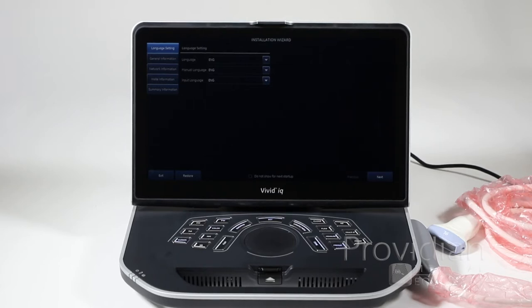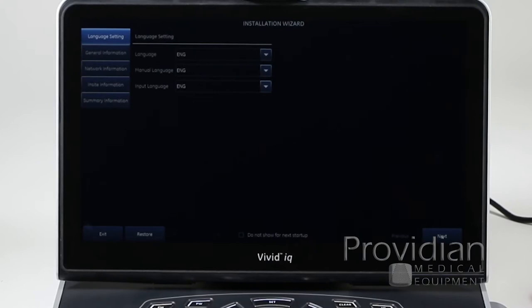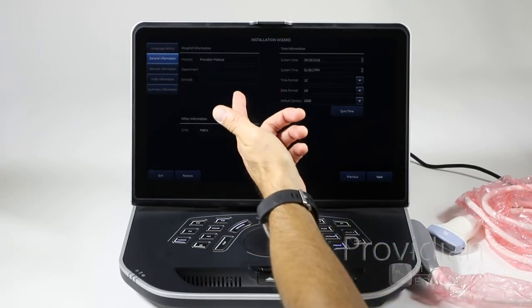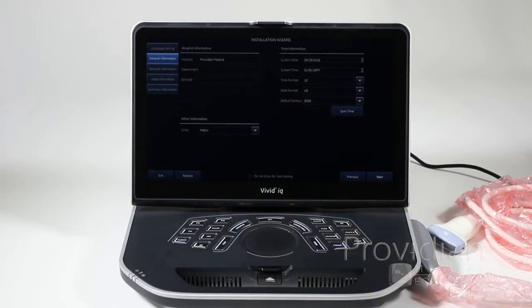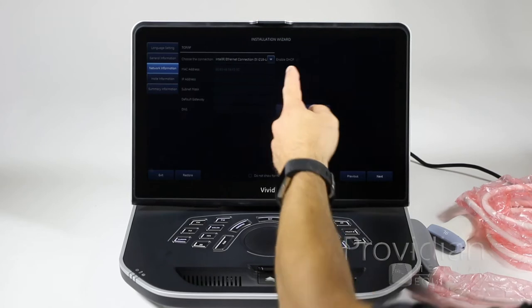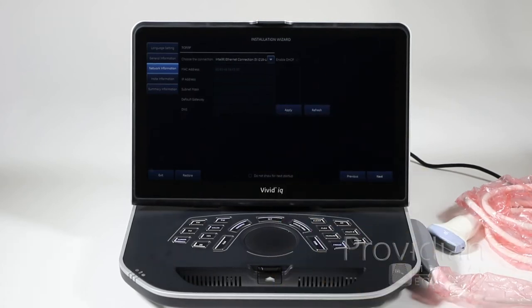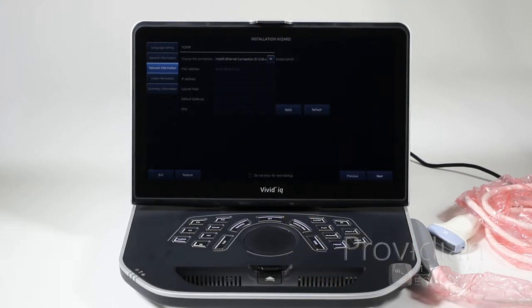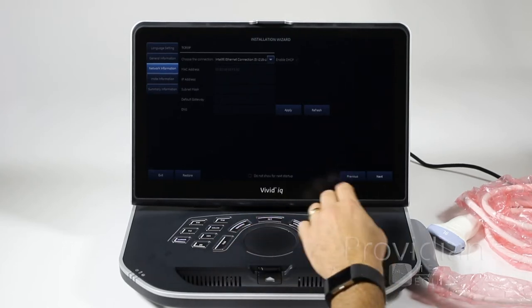The first time you start up your system, it may come to an installation wizard screen. It wants some information about you to set up the system appropriately so you don't have to dig through menus. You can choose your language, enter your name, set the date, type of units like metric or US, and what kind of internet connection you'll have. If you have a wireless dongle, this is where you would enter that and enable DHCP. If you aren't going to connect it to a network, you don't have to worry about that, but this is where you get that started.